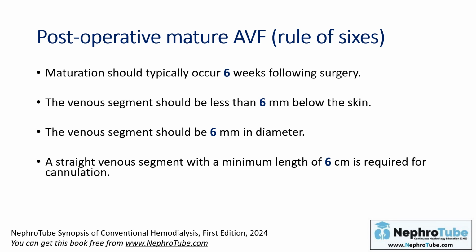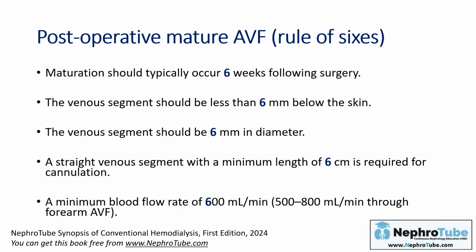This will help cannulation of the venous segment by the rope ladder technique that I will mention later. And finally, blood flow of the fistula should be 600 ml per minute. So these are the rule of 6 that indicates the maturation of AVF post-operative.